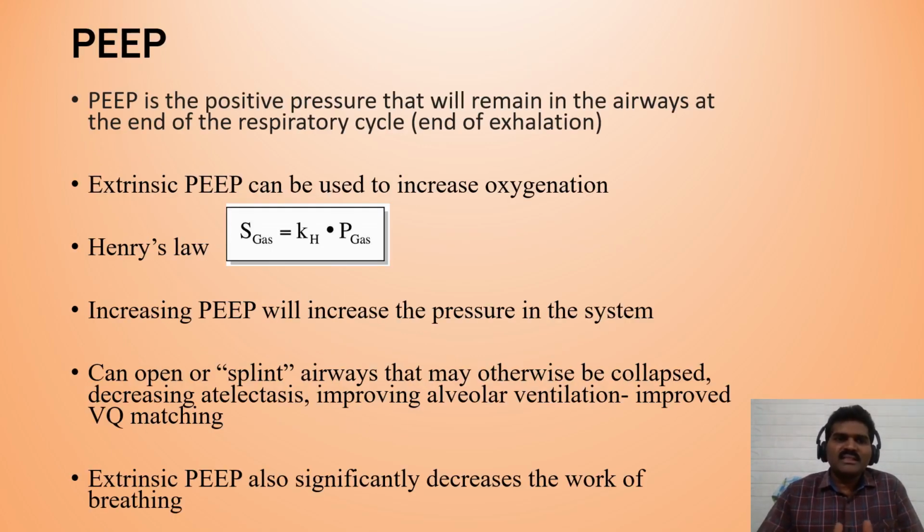As there is something called PEEP, positive pressure that will remain in the airways at the end of expiration or end of exhalation. Extrinsic PEEP can be used to increase oxygenation. Henry's law states that S gas is equal to Kh times the partial pressure of the gas. Increasing PEEP will increase the pressure in the system.